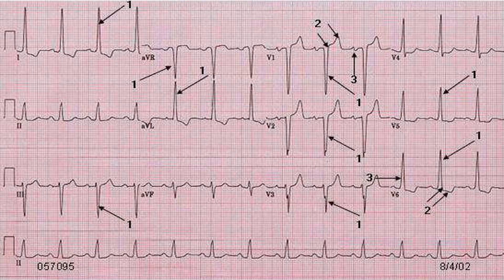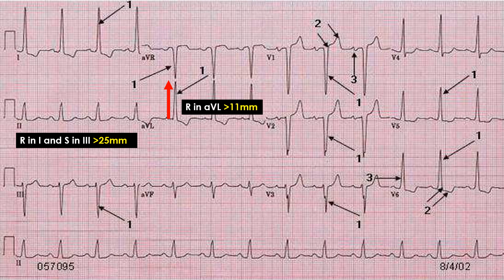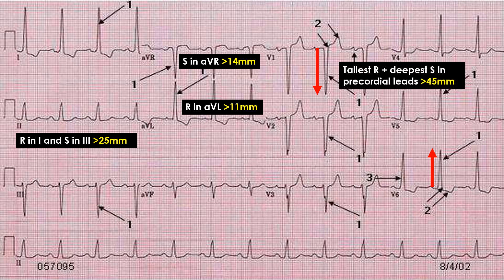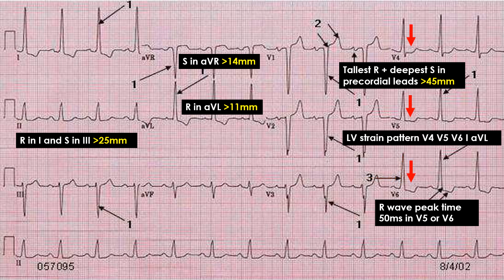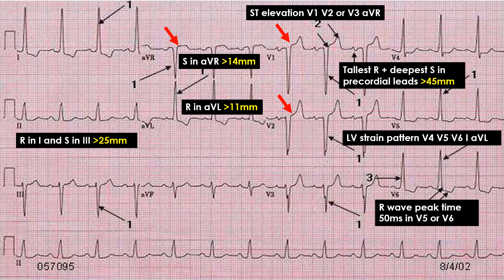This is a sample ECG tracing showing some of the voltage and non-voltage criteria of LVH. In the limb leads: R in lead 1 and S in lead 3 is more than 25 mm; R in AVL is more than 11 mm; S in AVR is more than 14 mm. In the precordial leads: tallest R plus deepest S is more than 45 mm. Increased R wave peak time in V6 and LV strain pattern in V4, V5, V6, 1, and AVL. And ST elevation in V1, V2, and AVR.